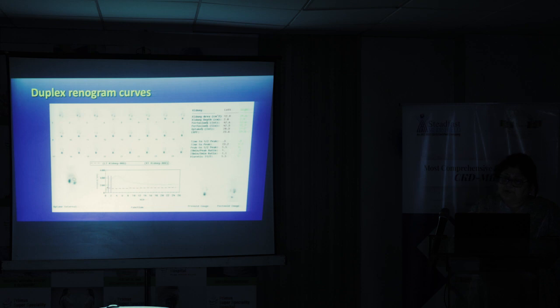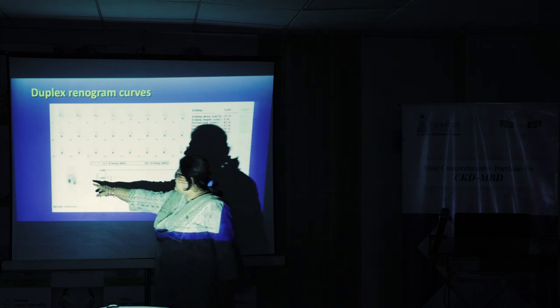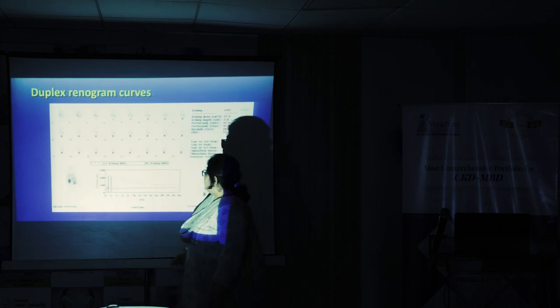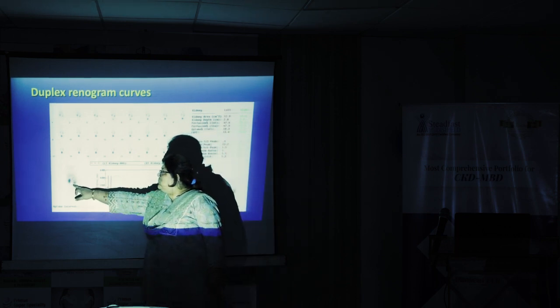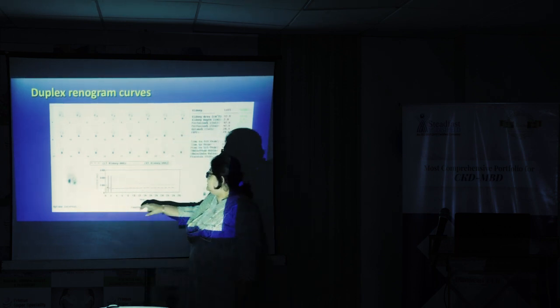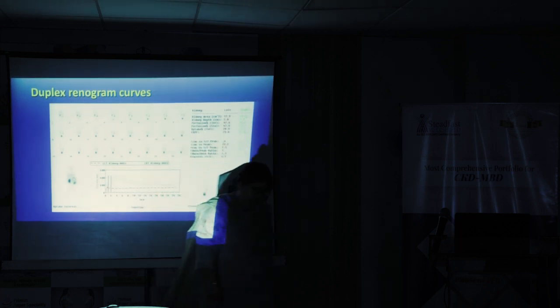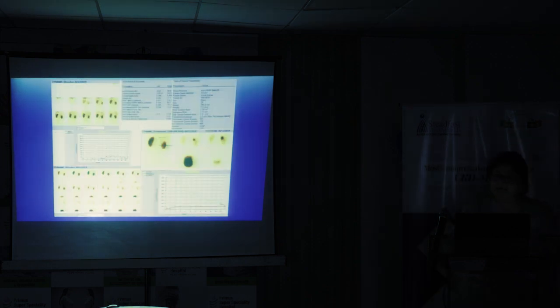But you can fool the system by drawing an ROI. If you can see this here, out here, this looks at the ROI. So you have fooled the system into drawing two ROIs, and you find that one ROI is showing obstruction and one is showing excretion. So the lower moiety is showing good excretion, whereas the upper moiety is showing an obstructive kind of pattern. Okay.